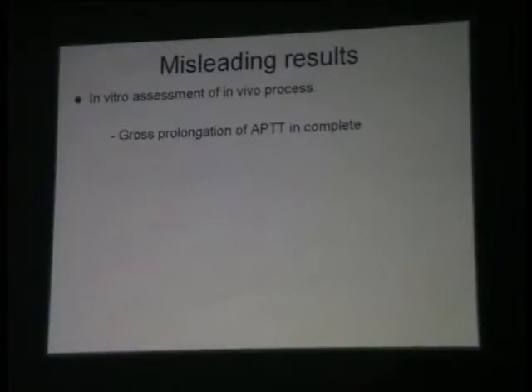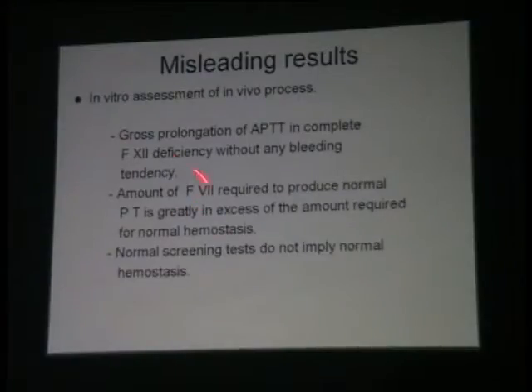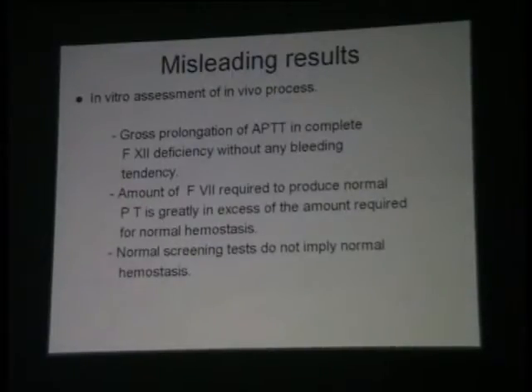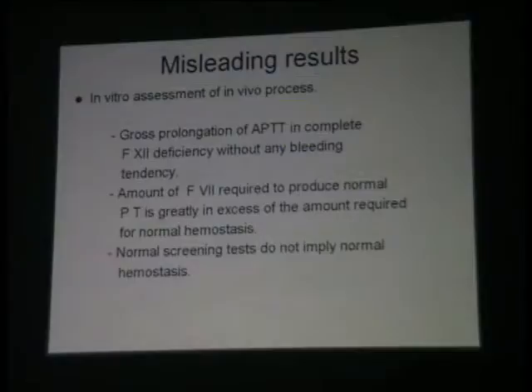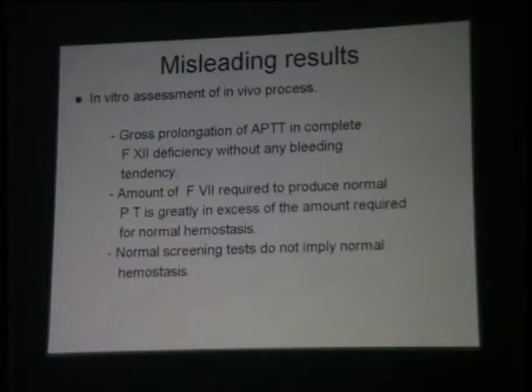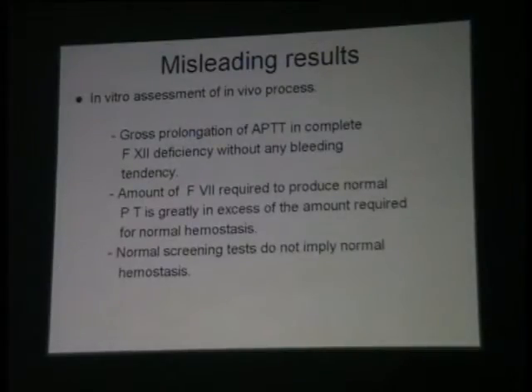Why can misleading results occur? We know that in factor 12 deficiency, as already mentioned, clinically there is no bleeding. However, in the laboratory, you will have blood which has not clotted and APTT which is prolonged, and yet you have a normal prothrombin time. Factor 7 required to produce a normal PT is present in excess because of the interaction of the two cascades. Please remember: screening tests do not imply there is no defect in coagulation. You can have a coagulation factor deficiency and yet all these tests may be normal.